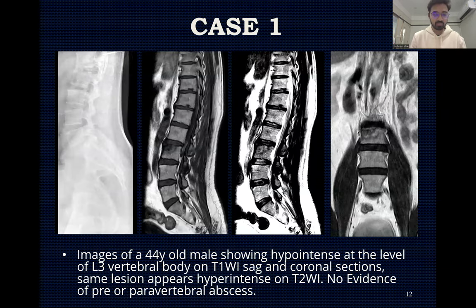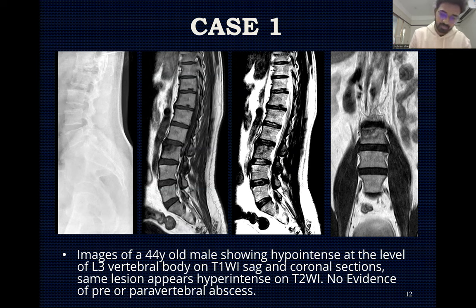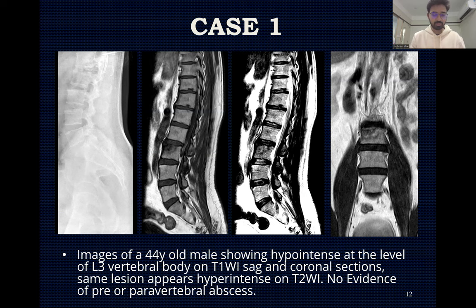Case one: Images of a 44-year-old male showing hypointense signal at the level of the L3 vertebral body on T1-weighted sagittal and coronal sections. The same area appears hyperintense on T2-weighted images. No evidence of pre- or para-vertebral abscesses was noted.